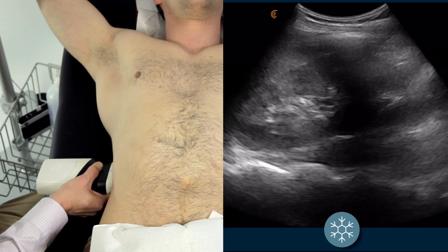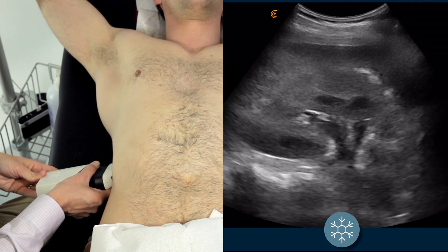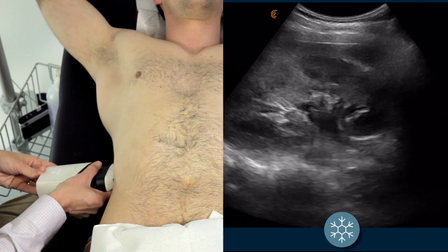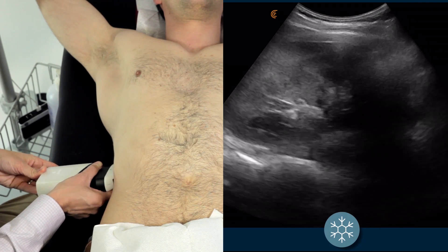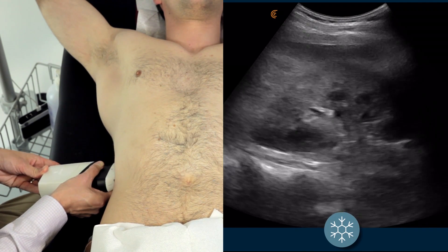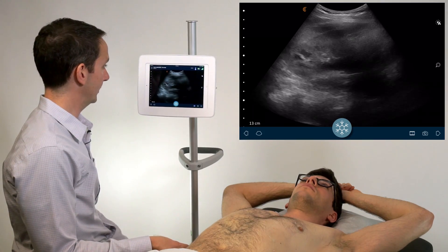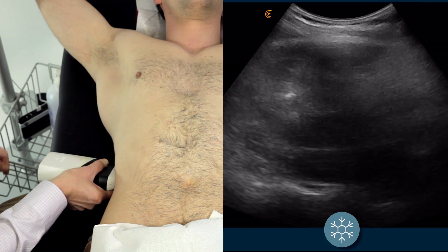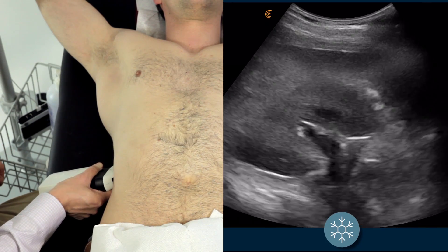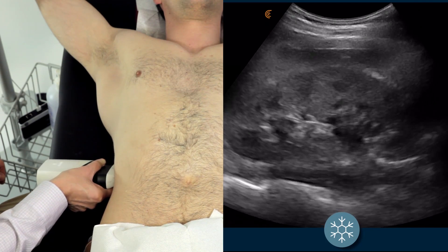If you've got a rib shadow in the way, a slight counterclockwise rotation of the scanner will typically place it intercostally rather than sitting on the rib itself. Then slowly scan through the kidney, assessing for any indication of hydronephrosis or stones.